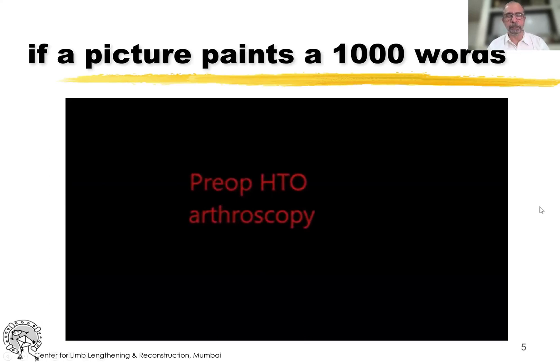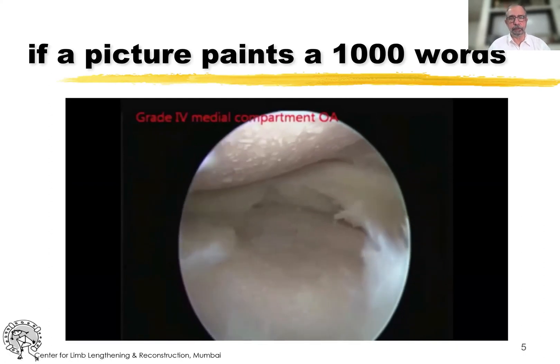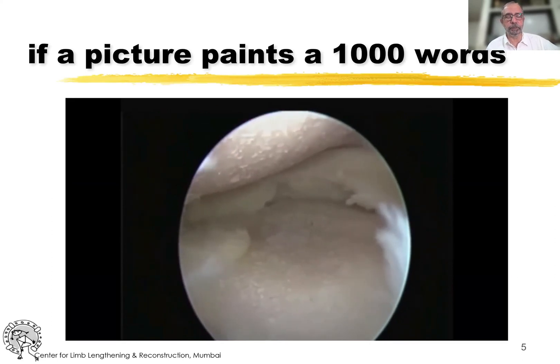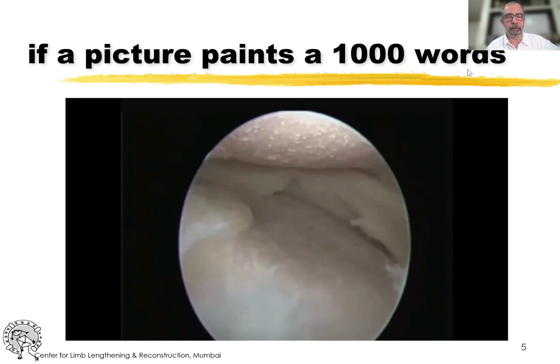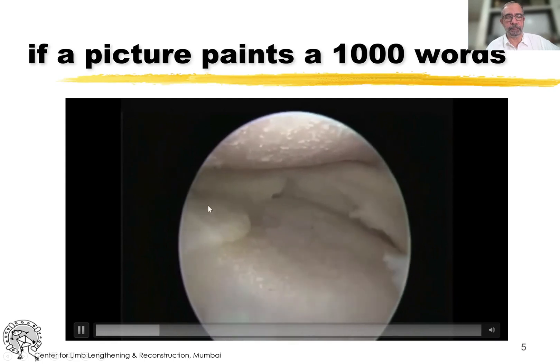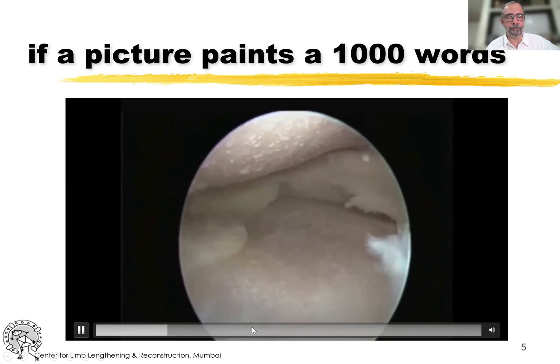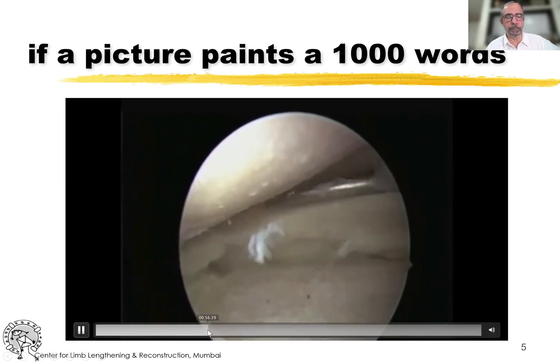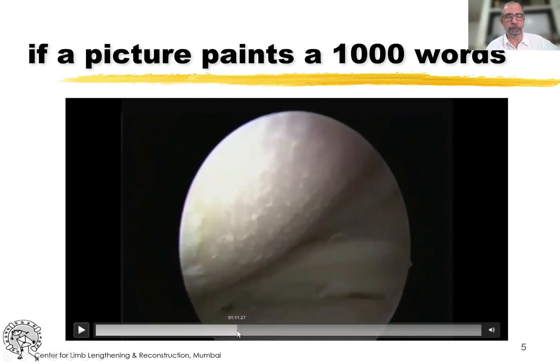Here's an example. This is a colleague who did an arthroscopy before the high tibial osteotomy. You can see bare femur, fibrillated edges of the meniscus, some cartilage, and again bare tibia. He did meniscal trimming, etc., and then did the osteotomy.